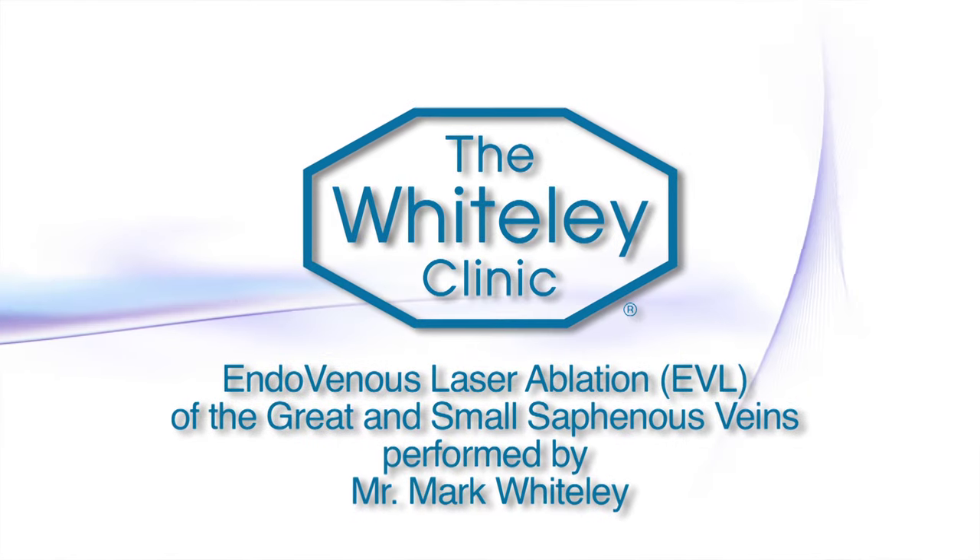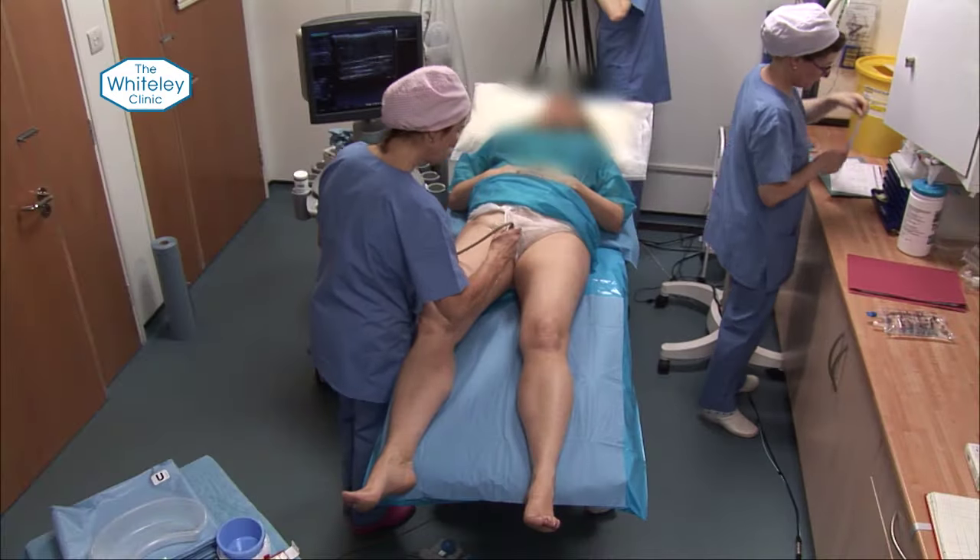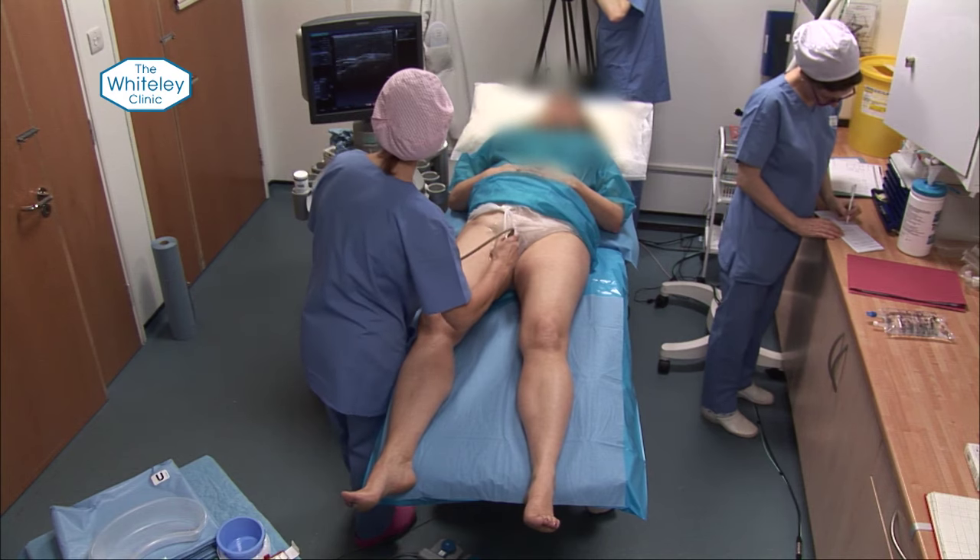The endovenous laser is an excellent technique to use for local anaesthetic. It's very fast and it also gives very secure closure, provided we get between 60 and 80 joules per centimetre all the way down. It's called the LEED, which is basically the linear energy density within the vein.